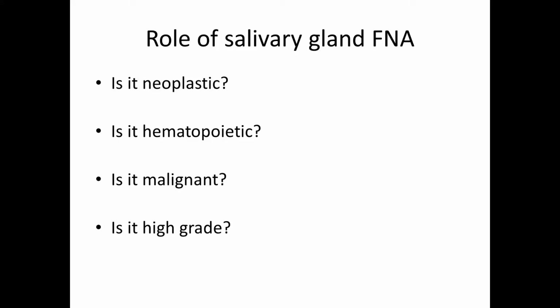The next important question, although not as important as you might think, is, presuming that we're dealing with an epithelial neoplasm, which is again going to be most aspirates, is this lesion malignant or not? Because that will have some bearing on the surgical approach and how the surgeon goes after the lesion. But more important than the question of is a lesion malignant or not is the question of is it a high-grade malignancy on the one hand or a low-grade malignancy / benign lesion on the other hand.